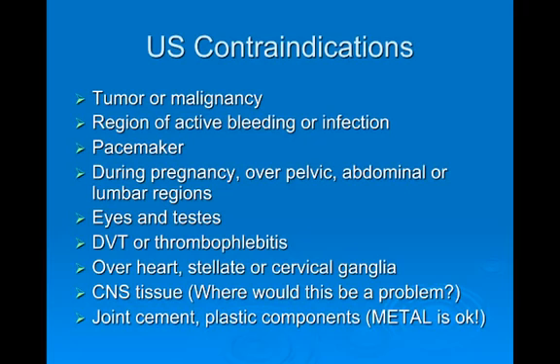Okay, so someone who's pregnant, again, over the critical regions, pelvic, abdominal, lumbar regions, somewhere where the ultrasound may affect the fetus. You're going to want to stay away from that. Over the eyes, over the testes, okay, reproductive organs, over a DVT or thrombophlebitis. You might break that clot loose.